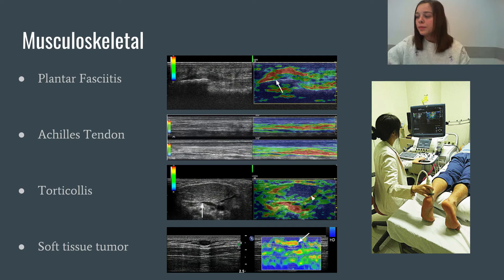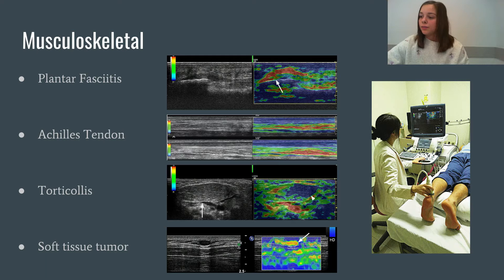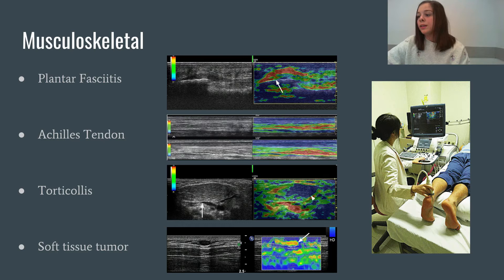The image beside plantar fasciitis is from a 72-year-old woman presented with right sole pain and discomfort during weight-bearing activities. The 2D image on the left reveals a thickened right plantar fascia. Simultaneous strain elastography on the right displays a green to red color in most of the lesion, indicating a softening of the plantar fascia. We can also detect Achilles tendon conditions. It appears as either homogeneously hard, but is mostly more than 60% inhomogeneously soft, displaying as longitudinal bands or spots. Most asymptomatic tendons tend to be consistently hard, ranging from 86 to 93%, with some containing mild or marked softening.